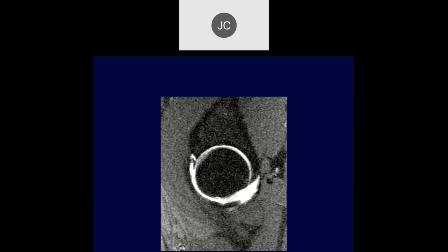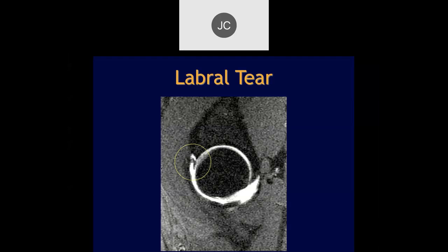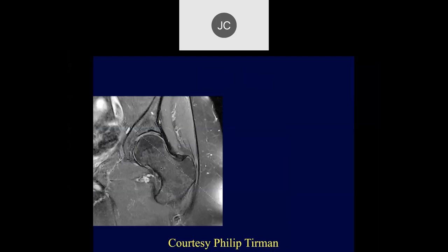Tason, what do you think of this one? In the anterior labrum there's a tear with a little bit of separation — a little bit of fluid going slightly external to the labrum itself. This was a confirmed labral tear.